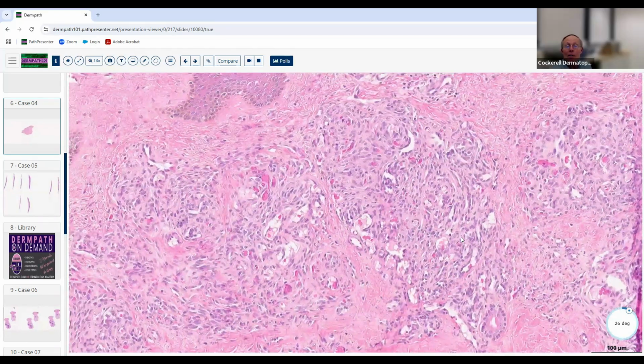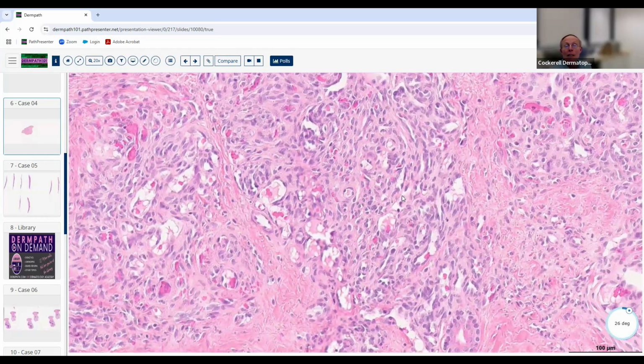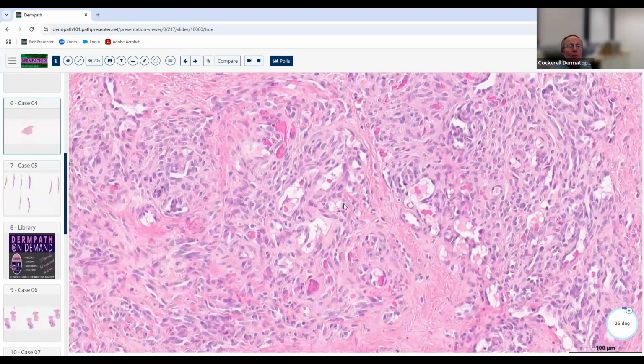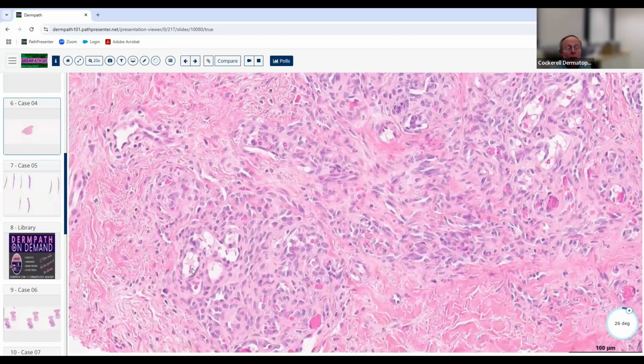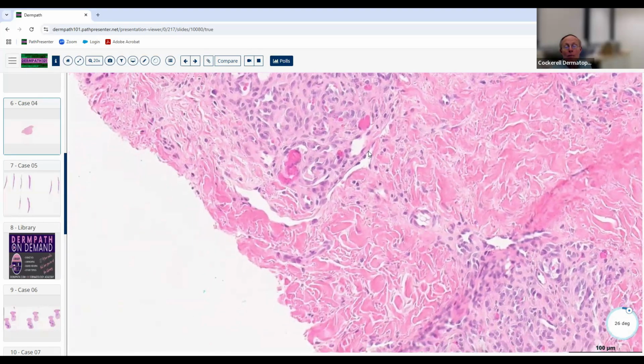Well, then we're going to go to higher magnification and look at the cytology. And now we get really concerned because these cells are very large, they're plump, they're hyperchromatic. They have atypical endothelial cells that are present in the lumen of a number of these vascular spaces. So now we get very concerned that we're dealing with an angiosarcoma. It's also got these other vessels that are really, really bizarre and have this so-called staghorn appearance, staghorn or deer horn or elk horn, whatever you want to call it. That's more characteristically seen in an angiosarcoma than in a typical small hemangioma.